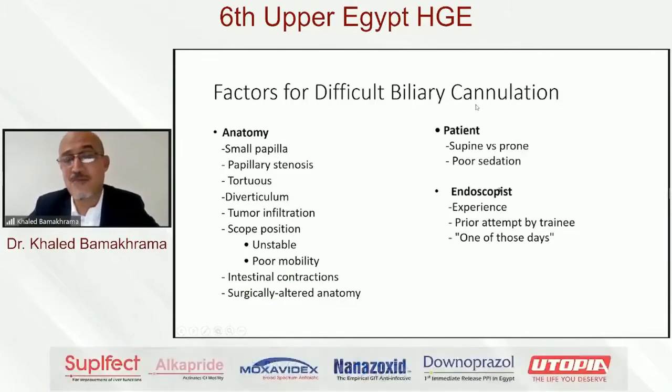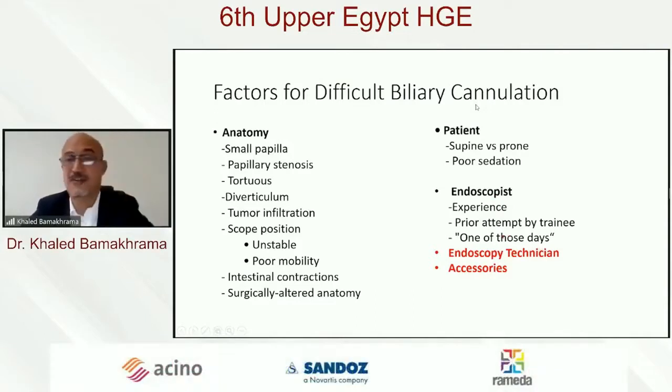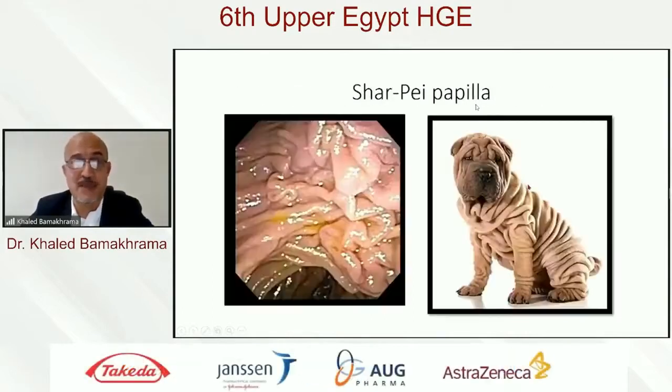The other very important factor is the endoscopist and his experience. Not only this, but I would also include the endoscopy technician. You need to have a dedicated technician for doing such advanced procedures. Not only this, but you also need to know your accessories that give you the answer in an easy way.